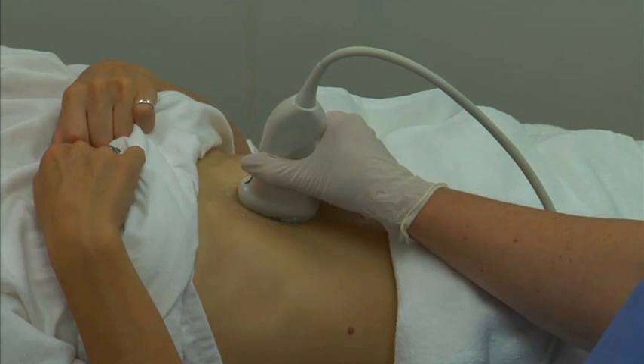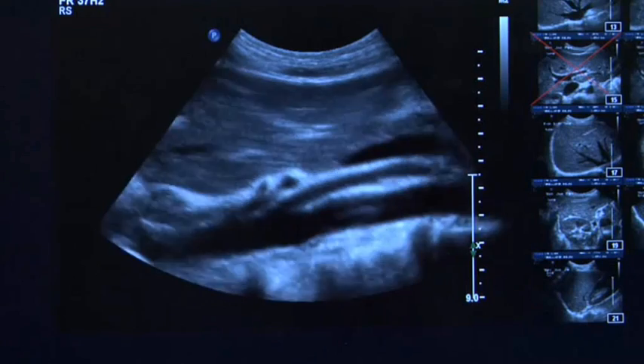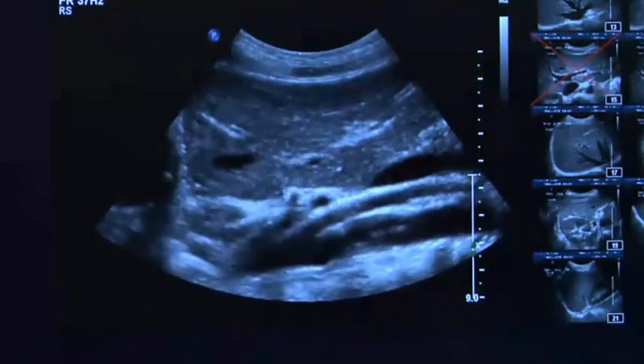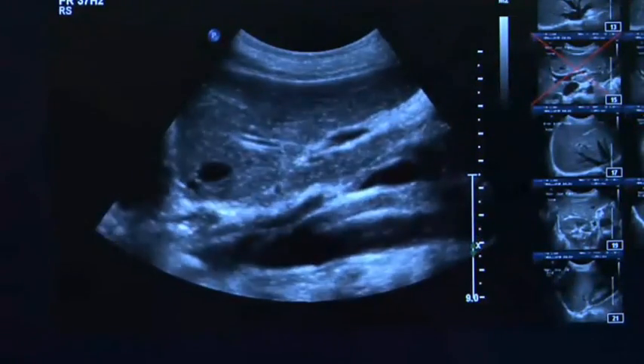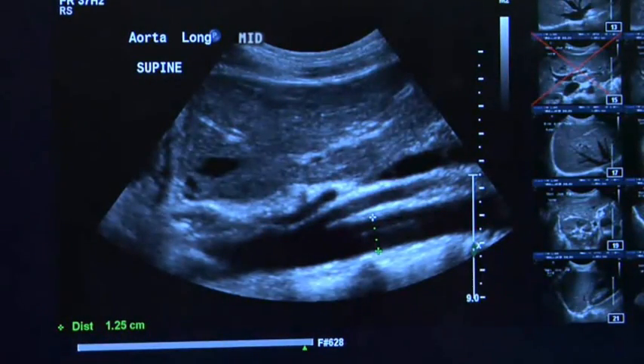Next, slide the transducer distally until the superior mesenteric artery is seen. Manipulate the transducer until a suitable image of the mid-aorta is obtained. Measure the diameter of the aorta in the long axis, just distal to the superior mesenteric artery.